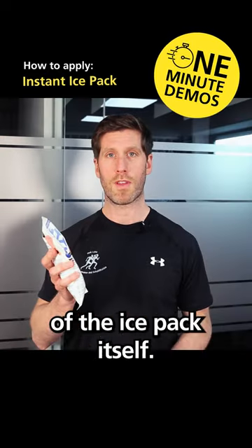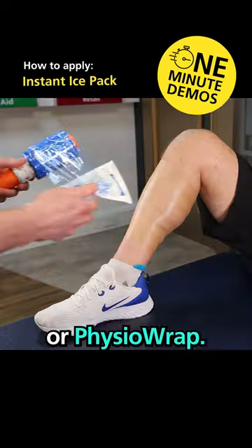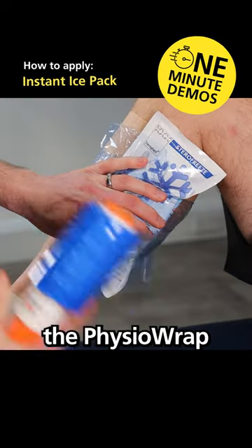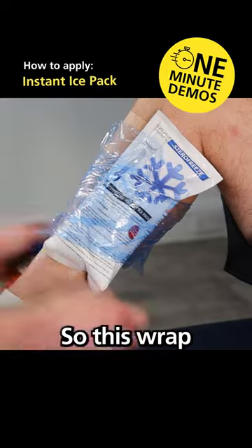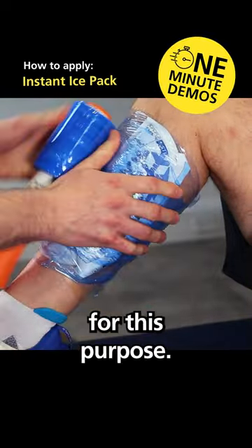Step three is the application of the ice pack itself. We're going to use some compression — you can either use cohesive bandage or physio wrap. We're going to pop the ice pack onto the injured area and use the physio wrap to wrap around. This wrap allows us to create some compression, and we can also use cohesive bandage for this purpose.